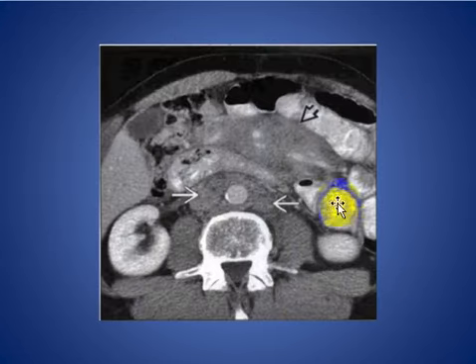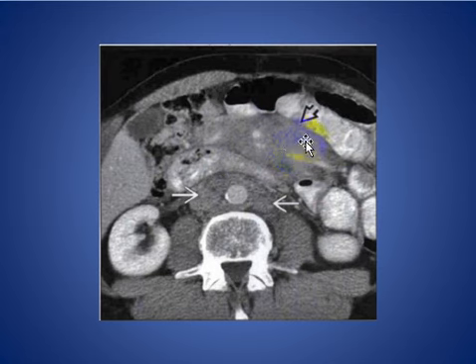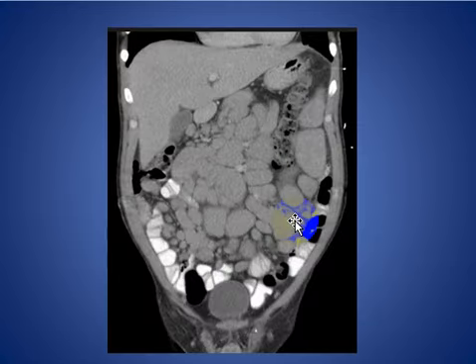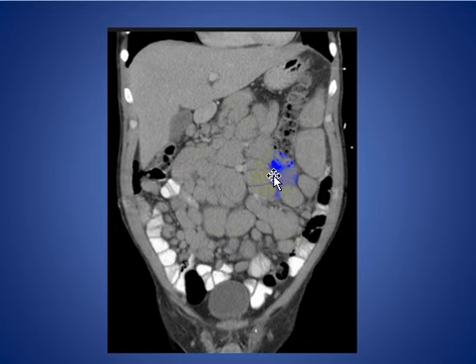Here you see a large mesenteric lymph node and retroperitoneal lymph node in a patient with non-Hodgkin lymphoma. This has a sandwich appearance. And here is another patient with non-Hodgkin lymphoma with multiple lymphadenopathy.